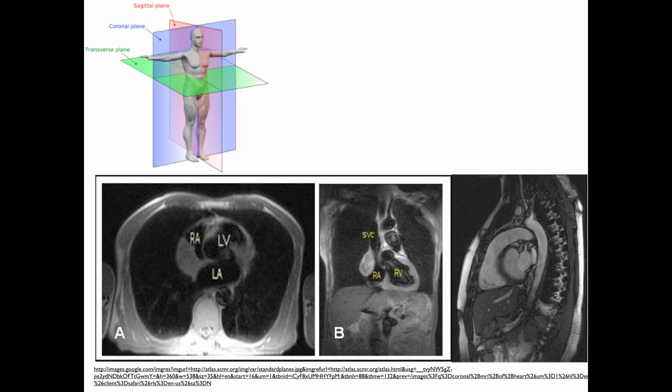So PET stands for positron emission tomography, and SPECT is single photon emission computed tomography. And so with tomography in its name, you know that this is a slice or has 3D capabilities. So before we get into this, a little bit more nomenclature.